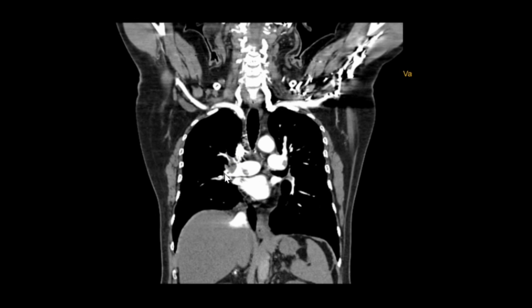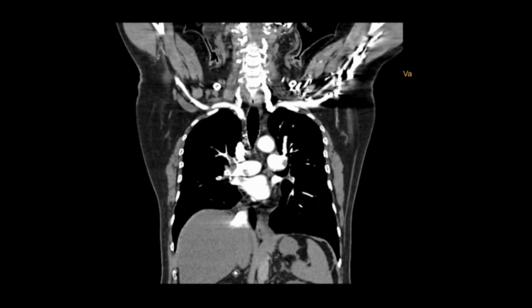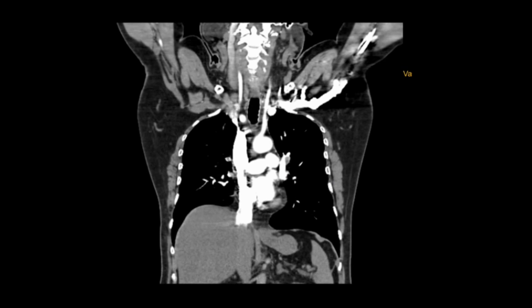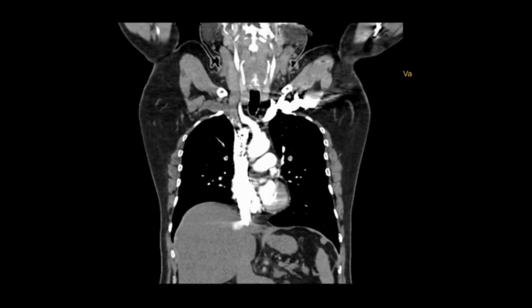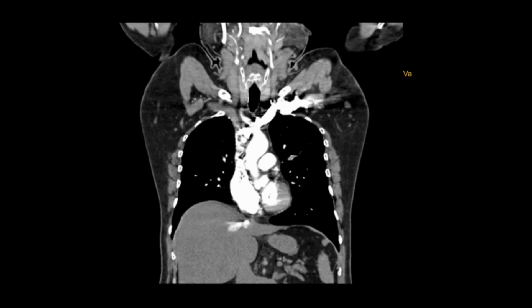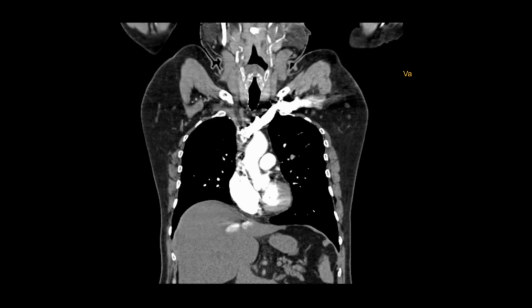Now we can see the thrombus extending from the main pulmonary arteries to the sub-branches. We can also see the heart and the streak artifacts from the contrast given via the left upper limb veins.